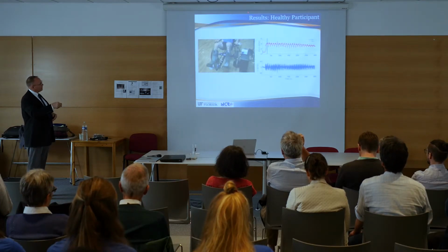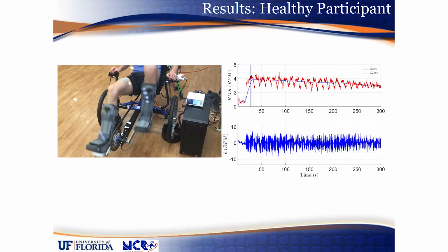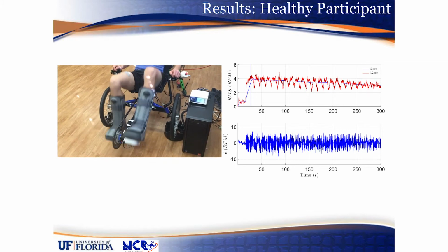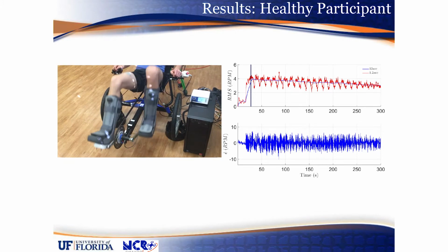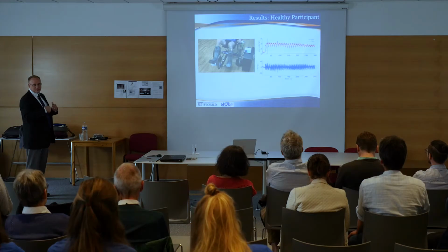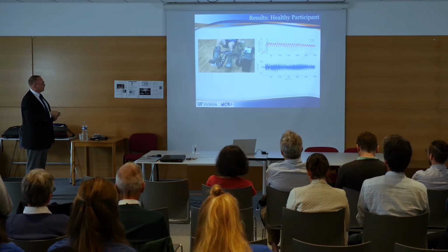And in a healthy normal participant, actually this is not a healthy normal participant, this is someone with a neurological condition. And I don't know why I have this video with this plot, but I think it's because on the next one I had 2 plots and there wasn't enough room. But on the healthy normal, what you can see is that over time the errors are decaying because the controller is learning and improving as it goes.